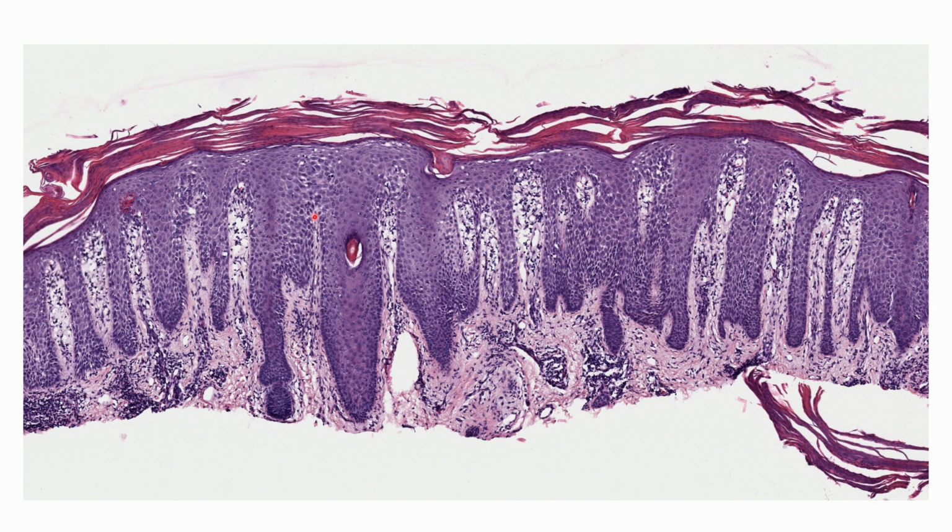First, you can see those regular elongation of the rete ridges resembling elephant legs. Second, we see those blood vessels, dilated tortuous capillary blood vessels. Third, we see thinning of the epidermis on top of this papillae. And lastly, we can see the parakeratosis mixed with neutrophils in the scale and no granular layer.